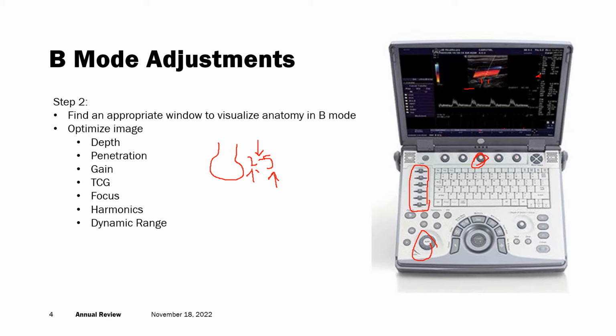So the rule of thumb is usually if you're scanning a whole area, say such as the liver, and you want to look at all of the liver tissue, you just put your focus at the very bottom, the very far field at the back of your screen, say down here. But if you're looking at something, maybe trying to see a common bile duct, or you're trying to do a measurement of a fetal part, something like that, then you would move the focus up to exactly the area that you're looking at. And you can see in this instance, the tech probably has their focus set about here, which is just beyond the vessel. Since their focus is the vessel, that's a perfect place to place it.